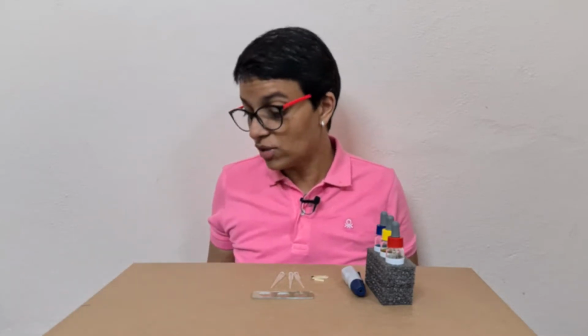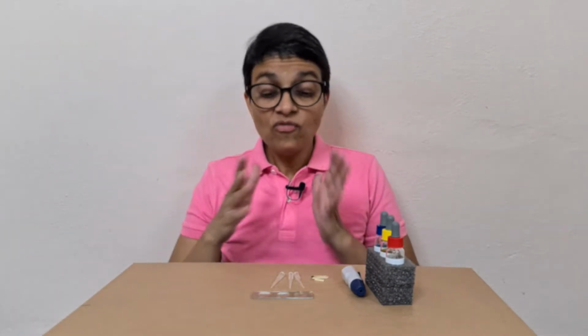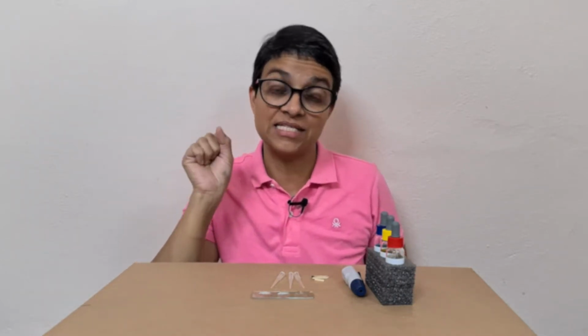We will be needing all this. Before we begin, it was Karl Landsteiner who identified the presence of A or B antigens on the surface of red blood cells.